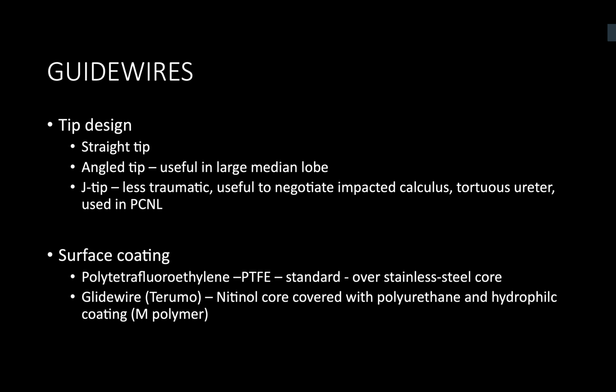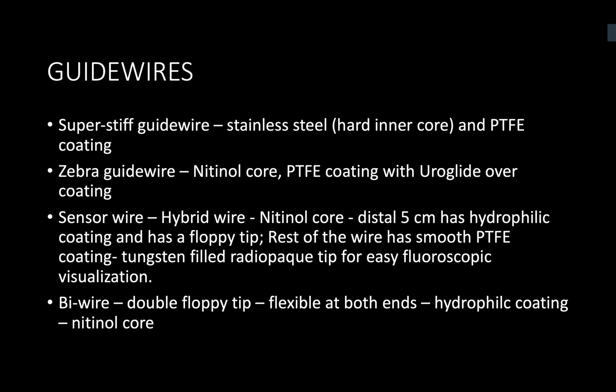What is the core of glide wire or Terumo wire made of? This consists of a nitinol core. Well done. Okay. What is the most common type of guide wire that you use in your daily practice? I use the sensor guide wire the most.